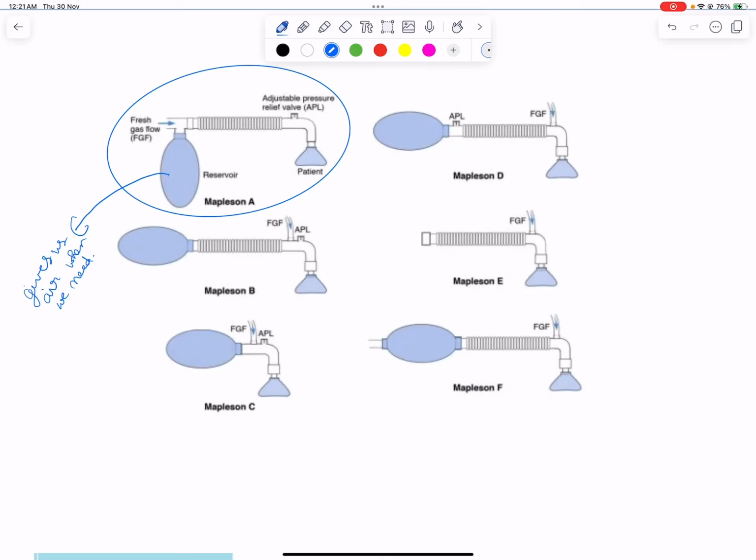See here, I would try to give you a brief view of Mapleson circuit, and there are lots of mnemonics lying around in YouTube and elsewhere. So I'm not going into mnemonics, but here I would try to give you understanding by which you can, if directly encounter the question in exam, and even if not revise this topic, you would be able to answer.